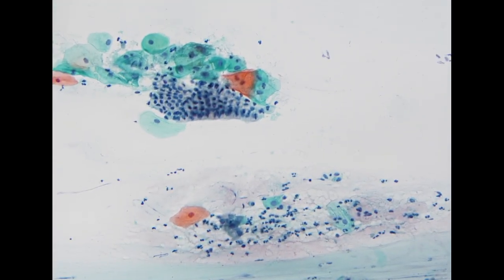On low power, she is 42, so we do see quite abundant superficial cells. We also see mucin in the background, and some endocervical cells, just like these over here. So we do have visualization of a good endocervical component, which means the specimen was well sampled. We do have the T-zone area.